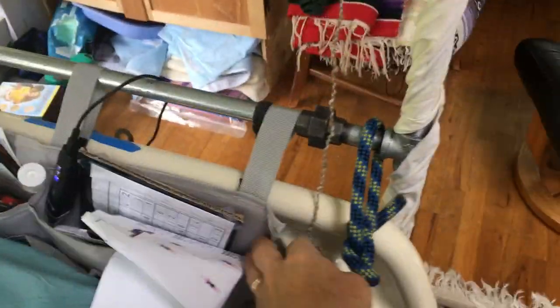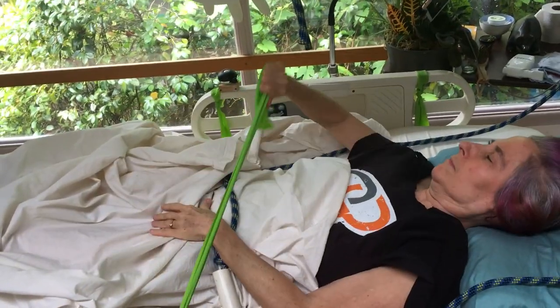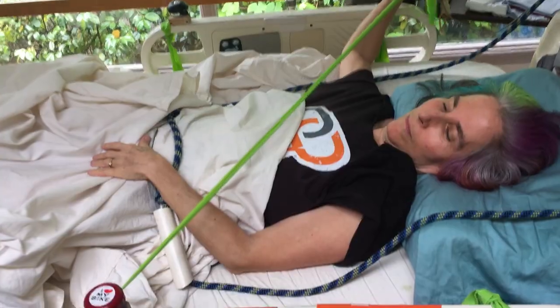The framework also gives lots of opportunity for putting on organizer units here at her head, and the stretch units on the side rails are super handy.